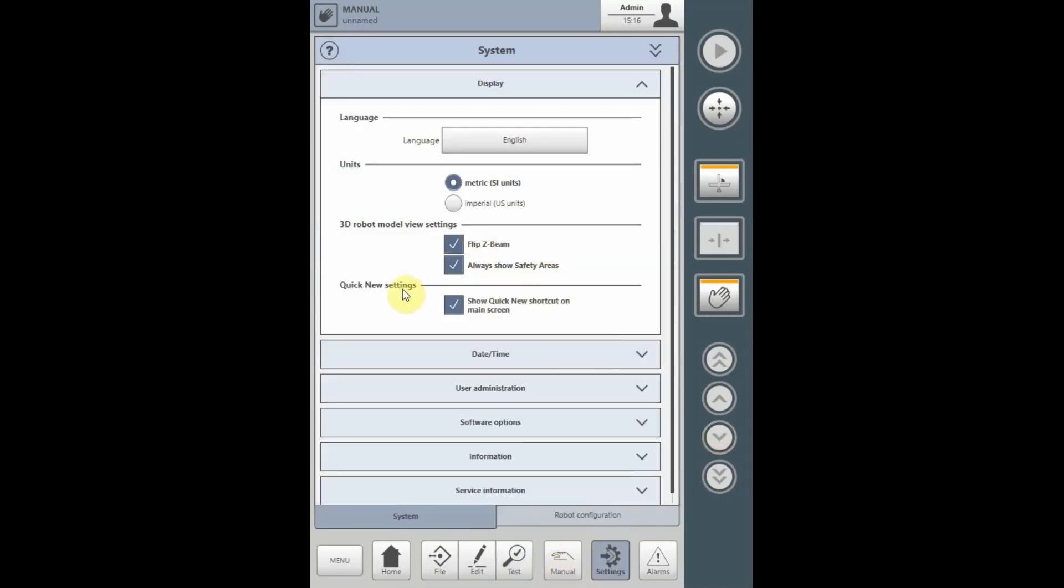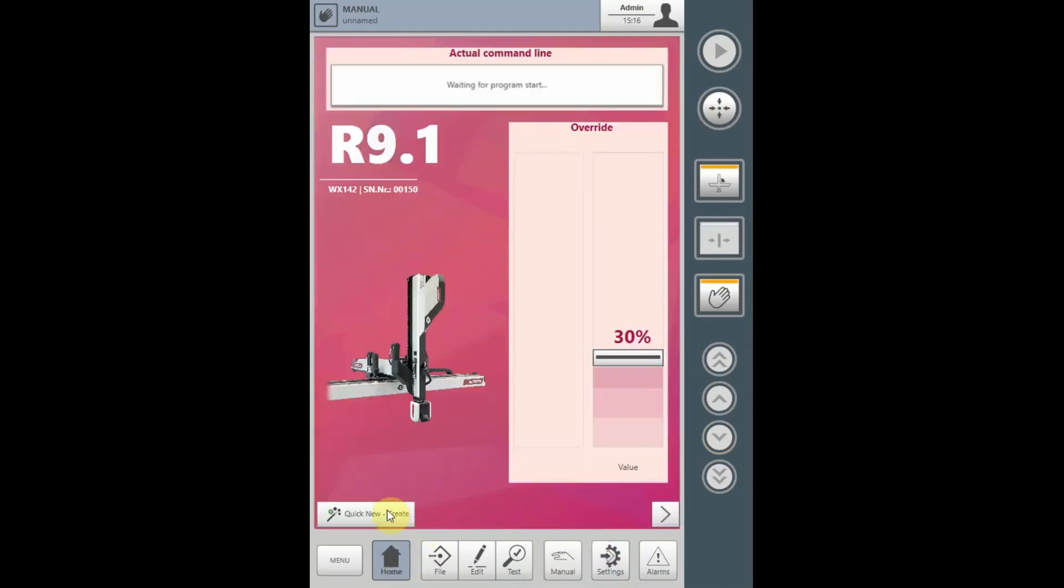The Quick New setting shows the Quick New Create button on the home screen to easily access the program generator from the home screen.